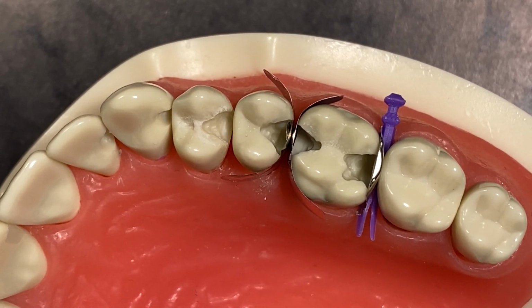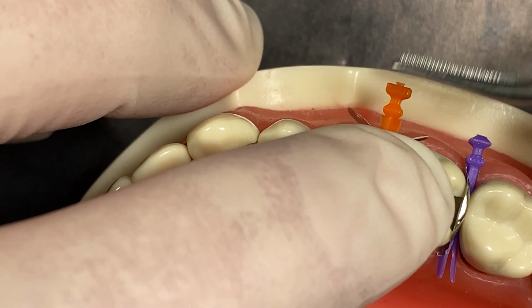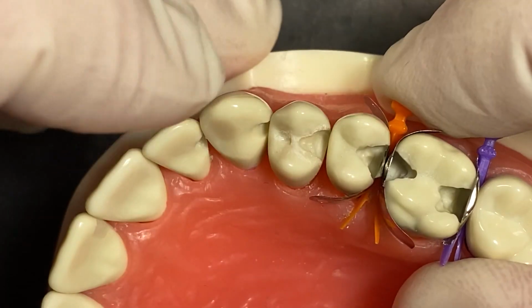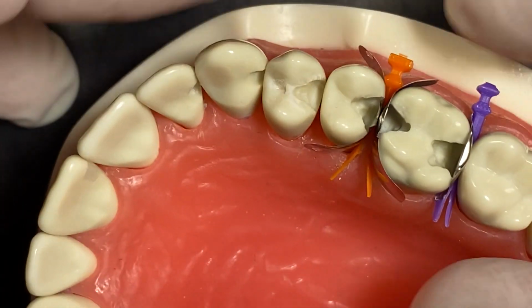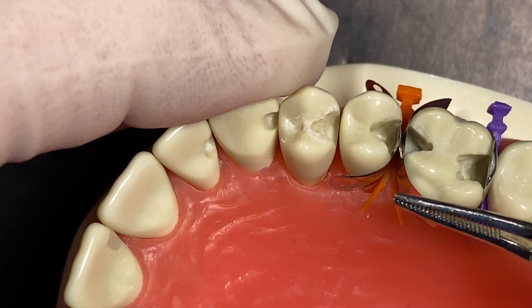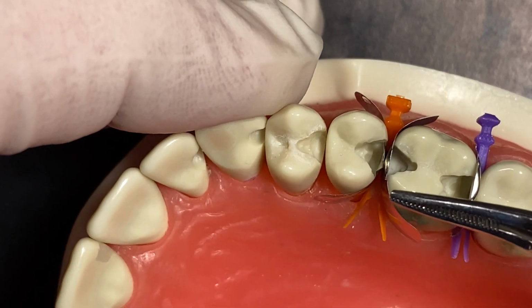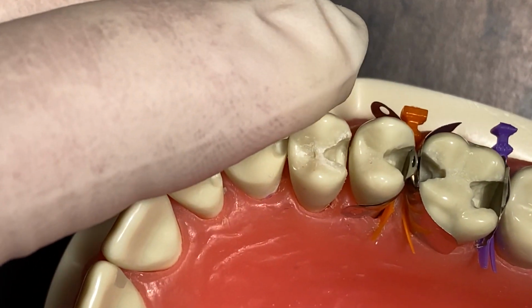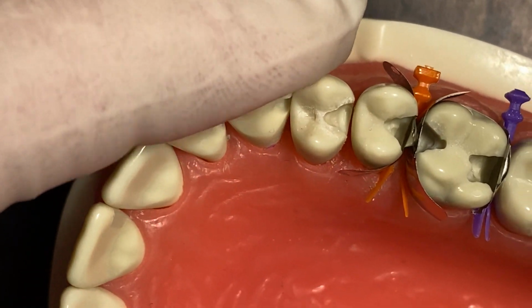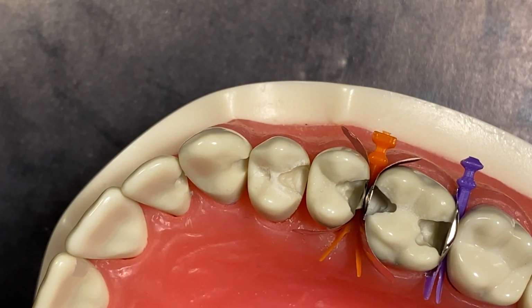But for the adjacents, what you're going to do is take the Versa Wedge, and you'll just pop that into place like so. And then as I push it into position, you can see how the wings of that wedge follow the sulcus of the 2 teeth and allow the wedge to really seal and push that matrix against 2 very differently contoured teeth. In these cases, you can either choose to ring stack or ring hop.